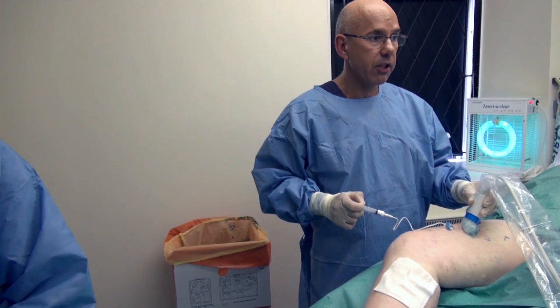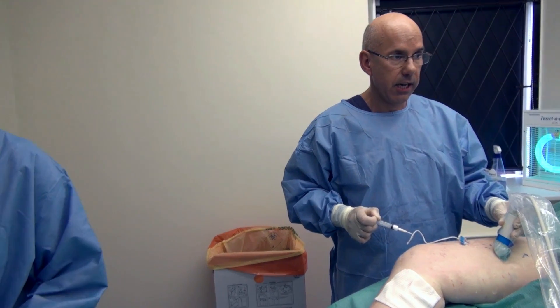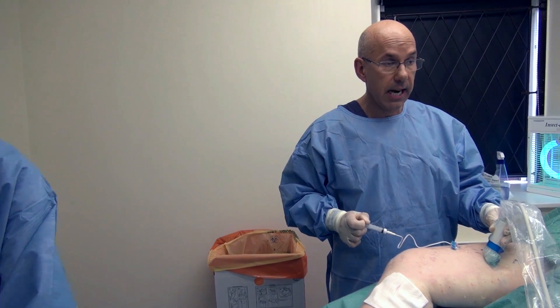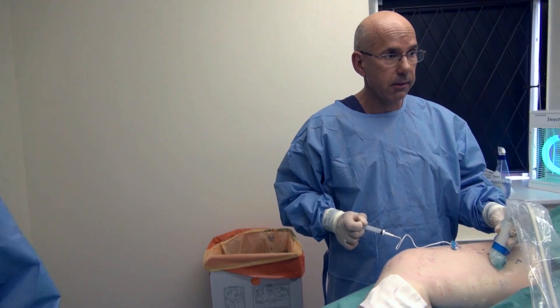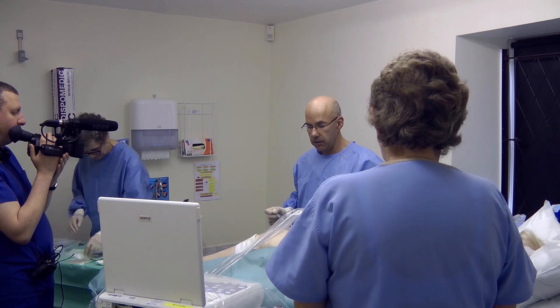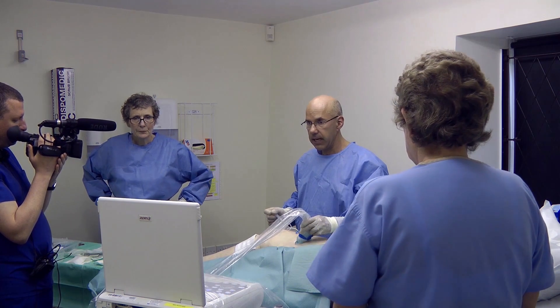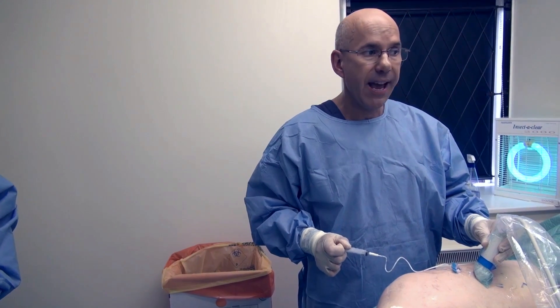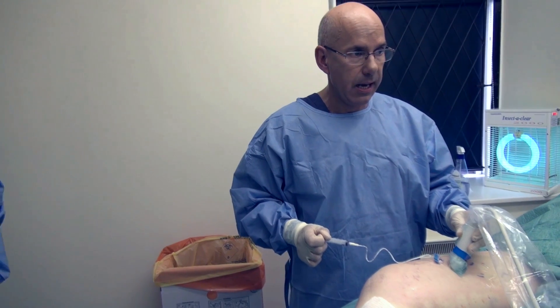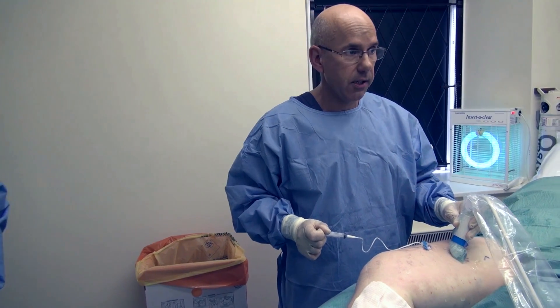We now have in total 4 criteria for successful cannulation and injection of foam sclerosant. I very frequently combine laser with foam sclerotherapy and phlebectomy all in one session. I think it's very safe and it deals with any veins which are slightly deeper in the leg that are not accessible to laser or phlebectomy. I have no evidence yet to suggest that it reduces the recurrence rate, but a priori it would suggest that it does.